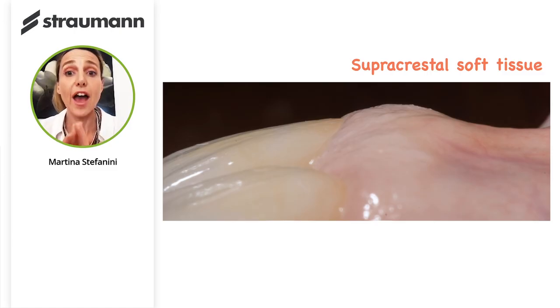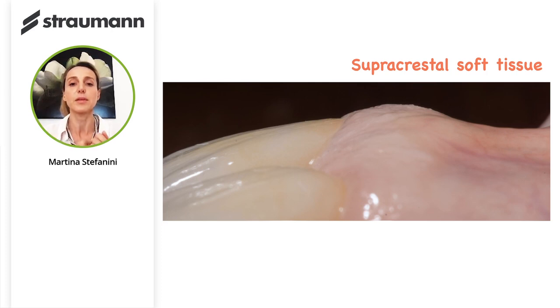So the only way we have to withstand and to reduce the risk of mucosal recession is to have a thicker soft tissue, thicker than 2 millimeters, in order to withstand the inflammatory process that usually occupies 1.5 millimeters, because even in presence of plaque or traumatic toothbrushing, we will have 2 millimeters of connective tissue that will be able to withstand this area of inflammatory process and will not experience mucosal recession.